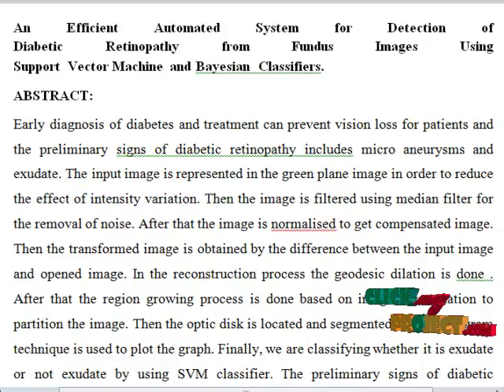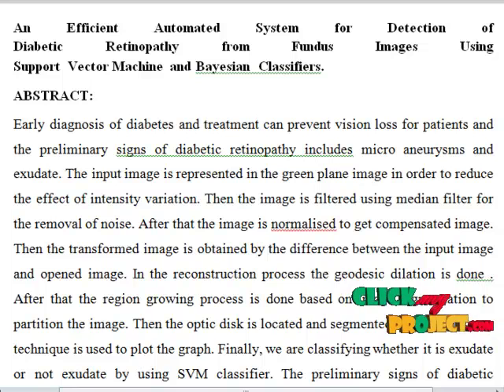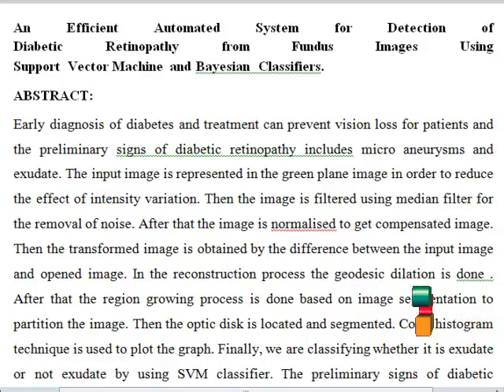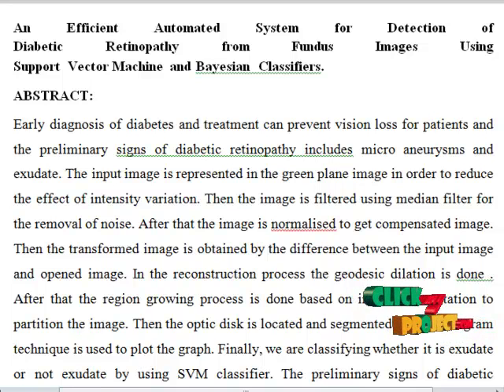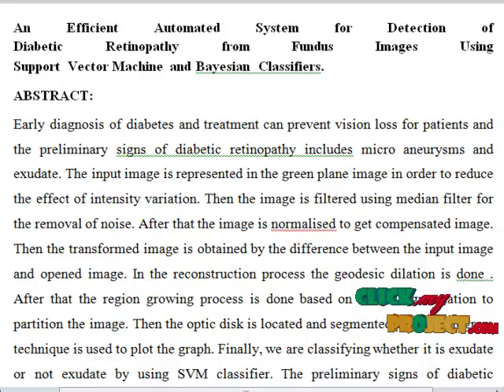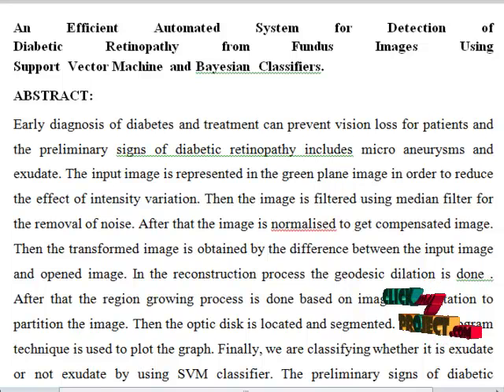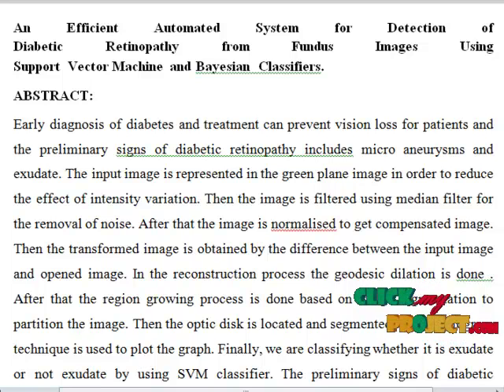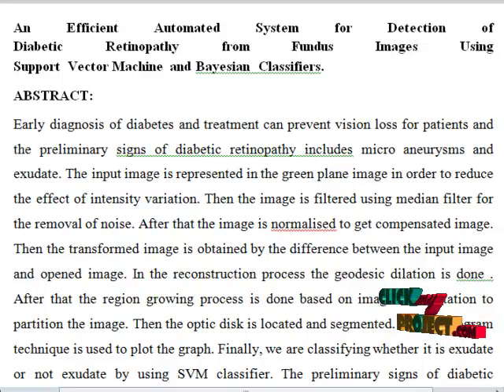Let us see the abstract for this process. In the preprocessing method, the input image is represented in the green plane and then filtered using median filter for smoothing, then normalized to get a compensated image. After that, the transformed image is obtained by the difference between the input image and opened image. The image is then reconstructed by geodesic and a threshold image is obtained by optimizing the threshold value. Region growing image is obtained and in the feature extraction area, circularity and aspect ratio are calculated. The optic disc is located and the image is segmented, with a graph plotted using color histogram technique.